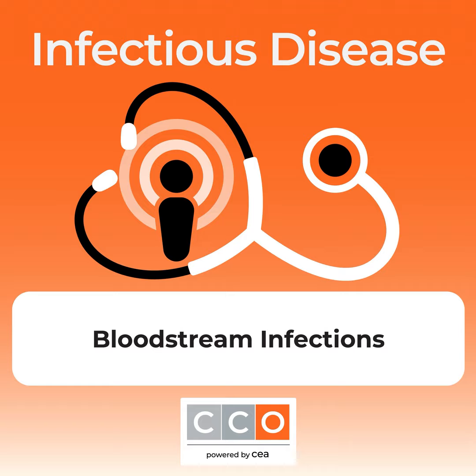Now, from a stewardship perspective, we think a lot about how these tests might help us target getting patients on more targeted, narrow spectrum therapy earlier. But these tests don't always necessarily mean de-escalation of therapy. And actually, one of the major benefits of these rapid diagnostic tests is that we can detect resistance genes, shortening the time to patients having appropriate therapy in multi-drug resistant organisms.